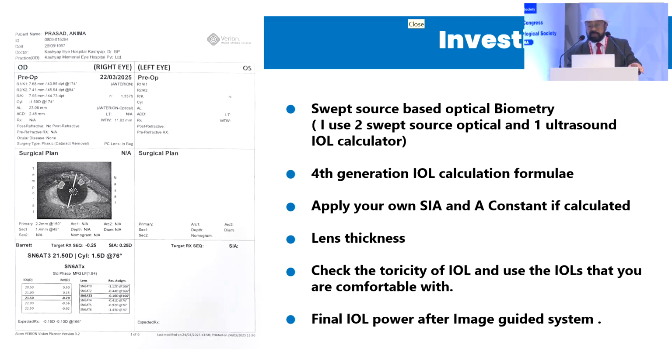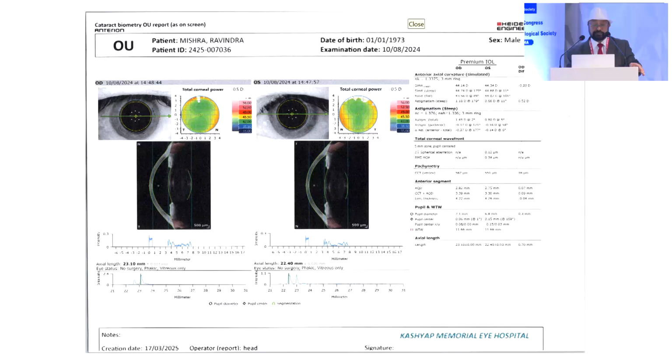Check the toricity of the IOL and use the IOL that you are comfortable with. And final IOL power after image guided system, that is we use Verion. There will be some overlap.